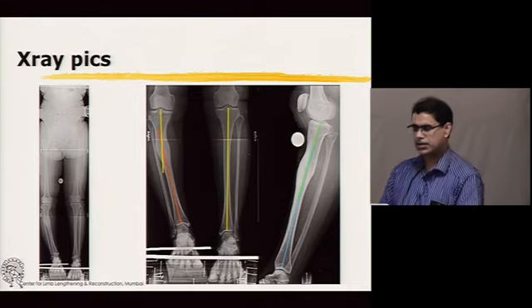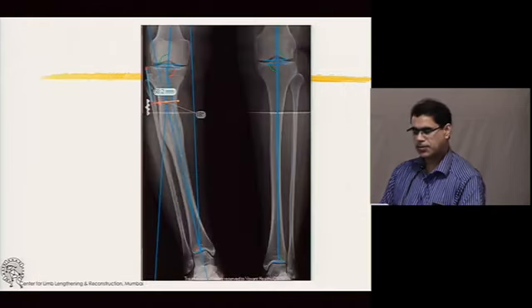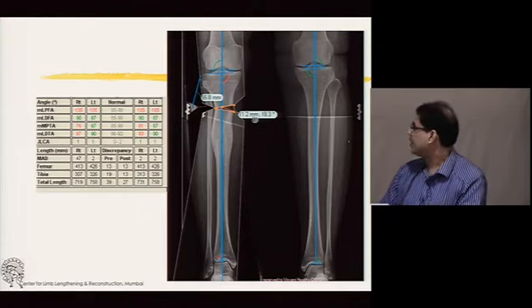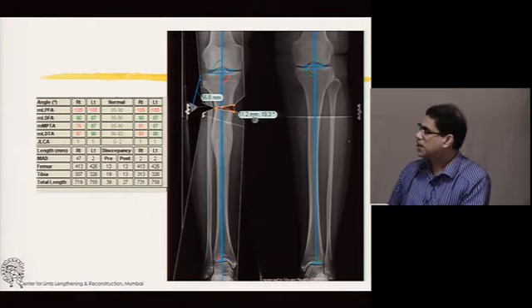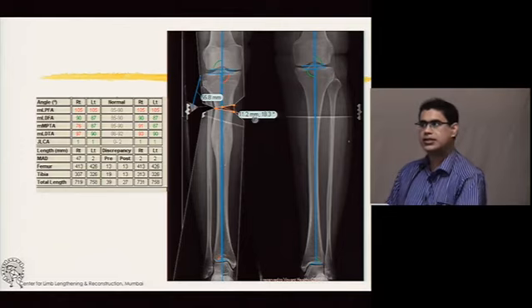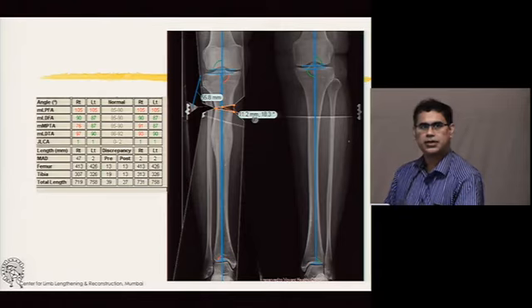There was a slight recurvatum as well in the sagittal view. So we use TraumaCAD software for our plannings, and this is a little bit similar to what we had got. But if you notice on the chart here, the femur also has about 13 millimeters of shortening. Therefore, as we were discussing earlier, a surgical tactic using internal fixation would still leave her with a short limb.